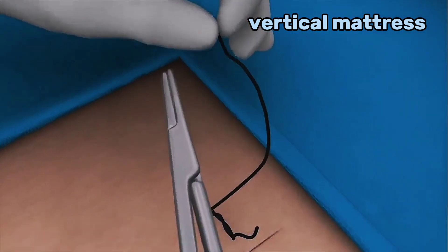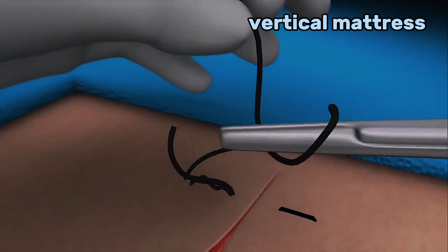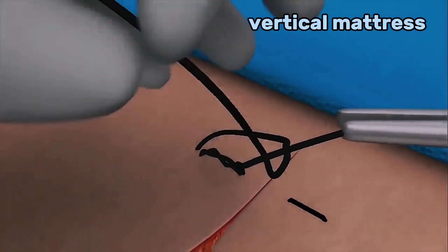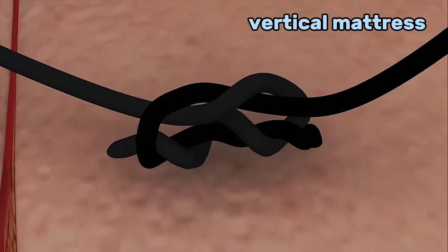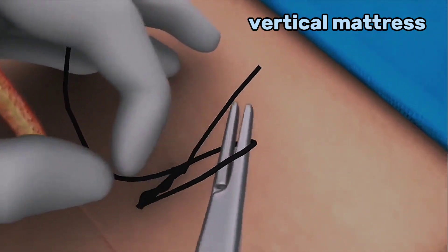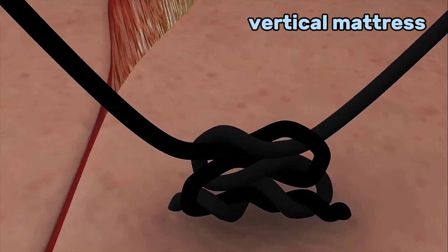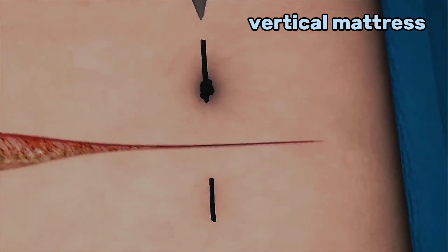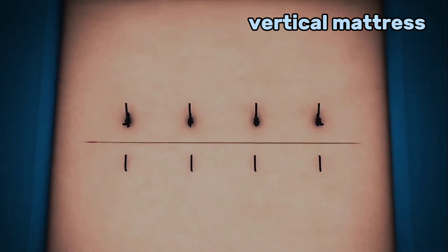This is then followed by a single backwards throw around the needle holder and again the end of the suture is pulled through the loop as it slips off the needle holder. Add a single forward throw in the same way to complete the squared knot. Trim the ends and continue with equally spaced vertical mattress sutures until the wound is closed.